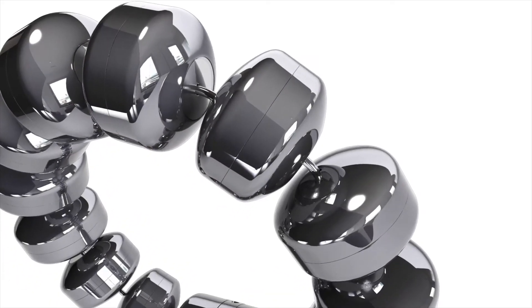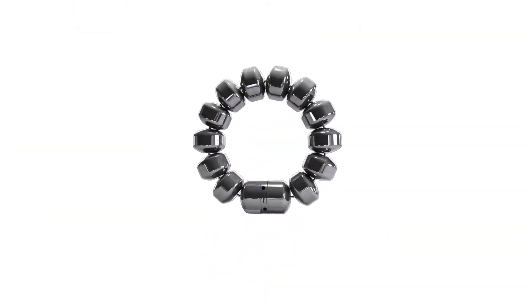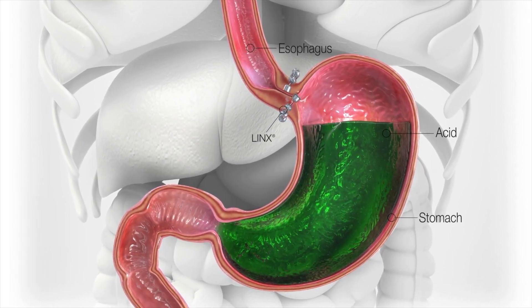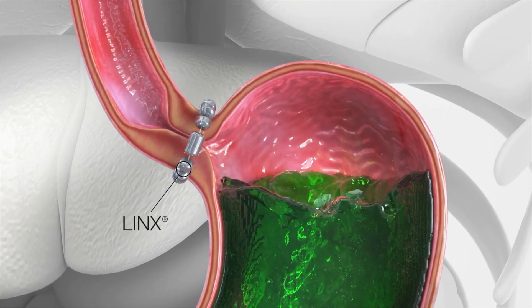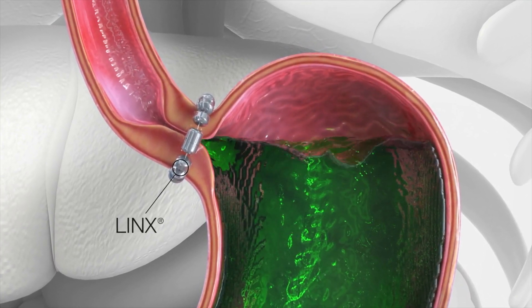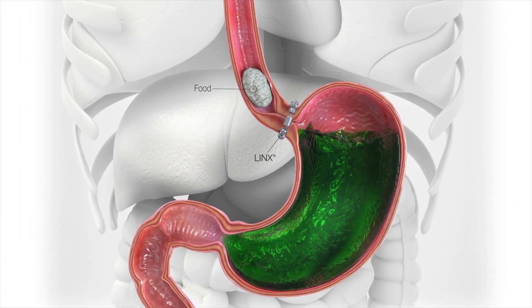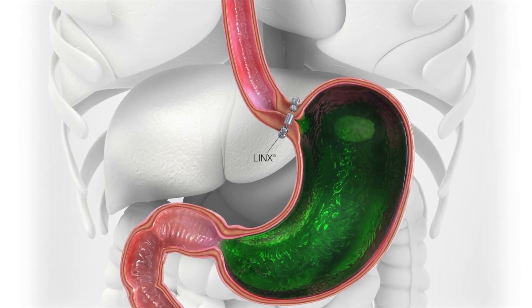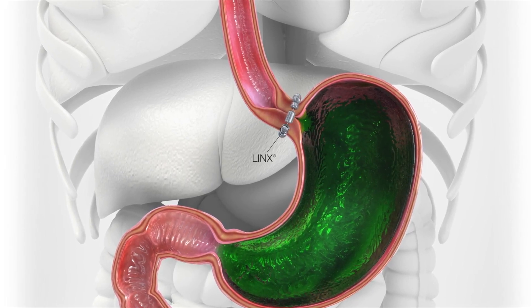At this point, the abnormally loose LES is then tightened using a flexible circle of magnetic beads called LINX. LINX can be placed around the lower esophageal sphincter, restoring proper valve functioning. The strength of the magnets helps keep the weak sphincter closed to prevent reflux. When the patient swallows, LINX opens temporarily to allow food and liquids to pass into the stomach, restoring proper one-way valve functioning of the sphincter.